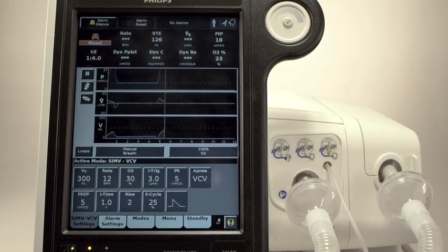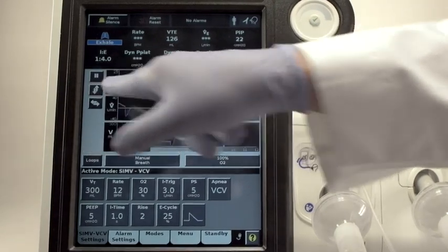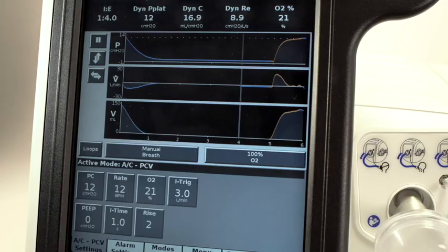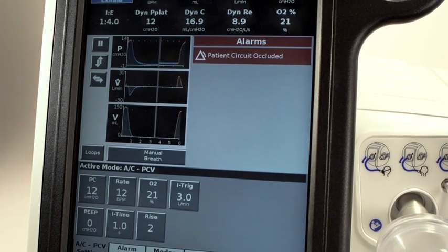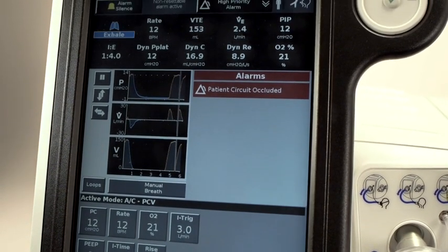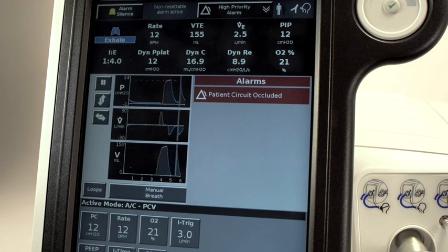V680 also has an emergency ventilation mode. In the event the exhalation side of the ventilator becomes occluded, inhalation and exhalation are performed through the inspiratory tubing like a single-limb ventilator until the occlusion on the expiratory limb is corrected.